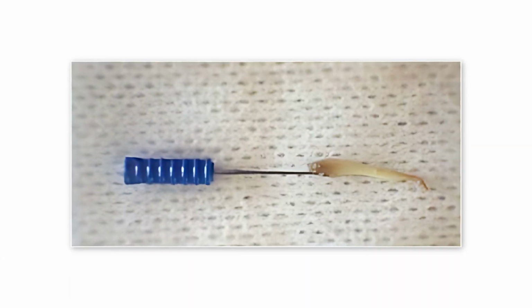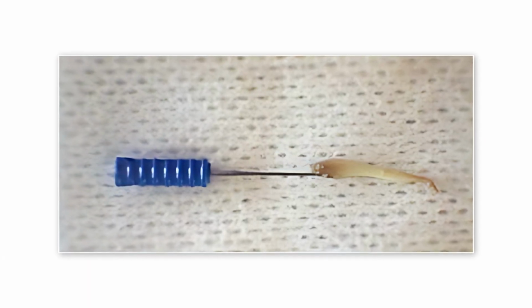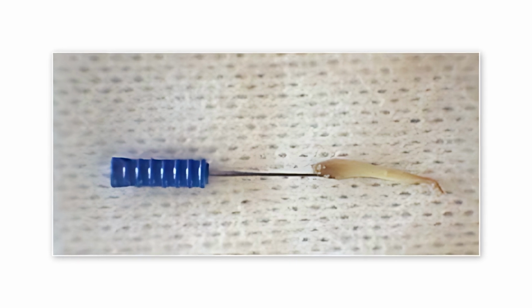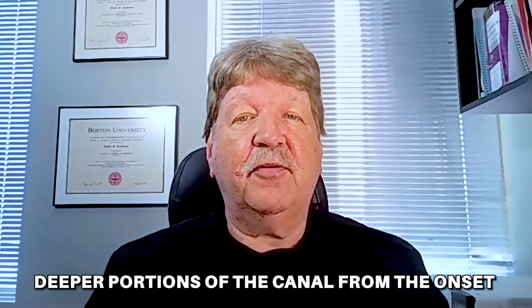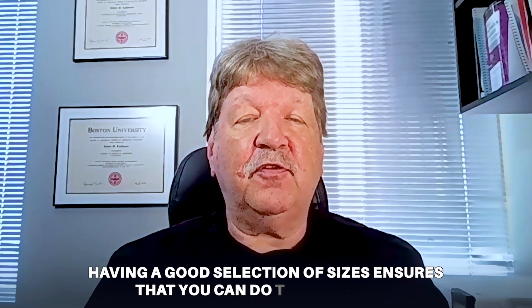I must admit that a certain level of satisfaction occurs when the appropriate size broach is used and the entire pulp contents come out in one piece. I know that irrigant will now be able to be used in the deeper portions of the canal from the onset, and I'll also spend less time negotiating smaller hand files in my attempt to do a thorough job of reaching the terminus and cleaning and shaping the canals. Having a good selection of sizes ensures that you can do this with ease.